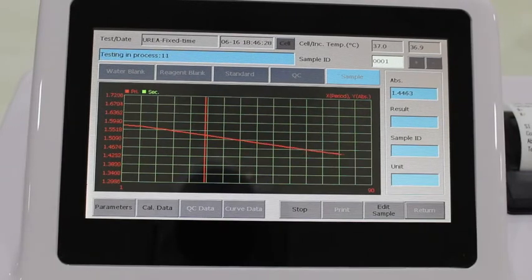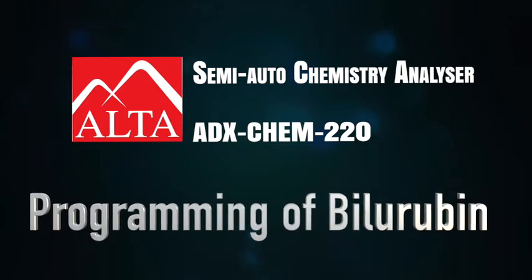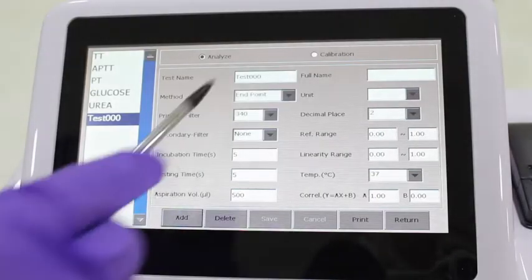Programming of bilirubin total—bilirubin total and direct is different as it is run in two-point end mode, or in some instruments indicated as a differential endpoint mode. Excess of bilirubin imparts color to the serum. To nullify the same, in bilirubin we generally run sample blank.